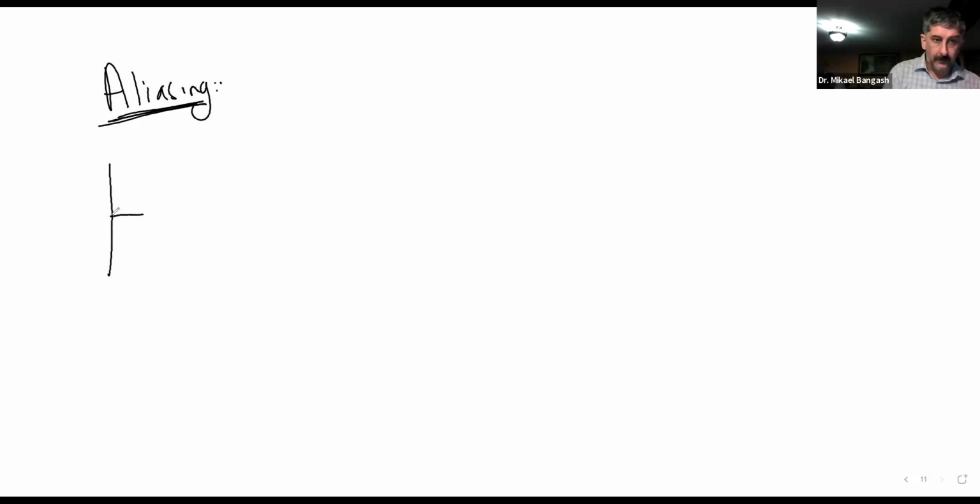So on a spectral Doppler, what caused us to get aliasing? If the Nyquist limit is crossed. Yeah.